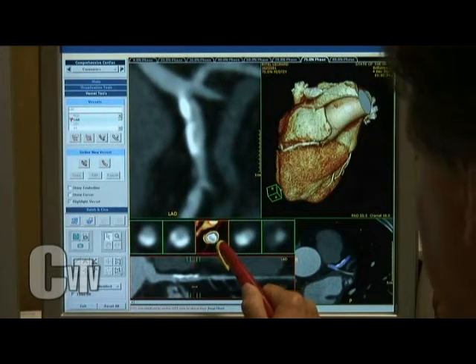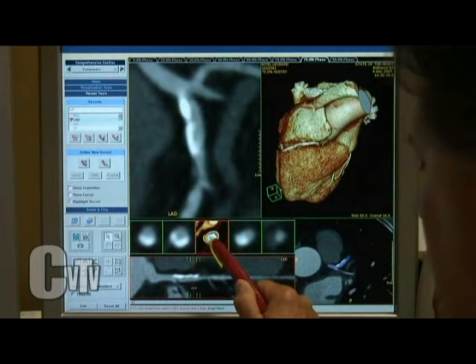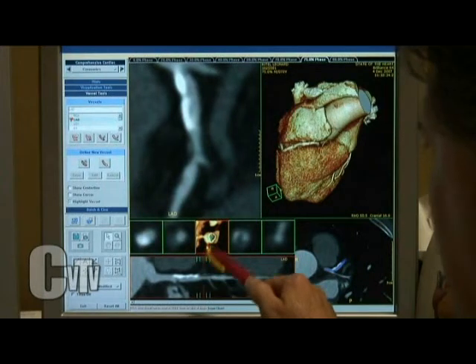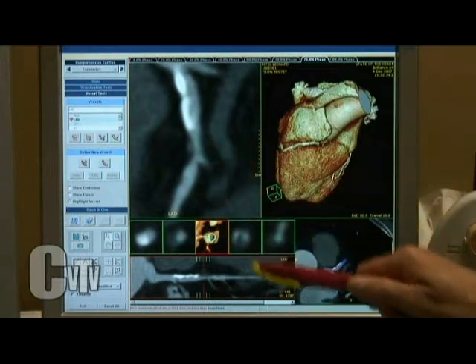You have vascular biology, which is the outside of this, and luminology, which is the inside. Right. So the fantastic voyage is, whereas if you go to a cath lab and you have a cath done, all they get to look at is what's inside the circle. That's all I can see. But what you can look at with your CTA is the circle and the donut, right?